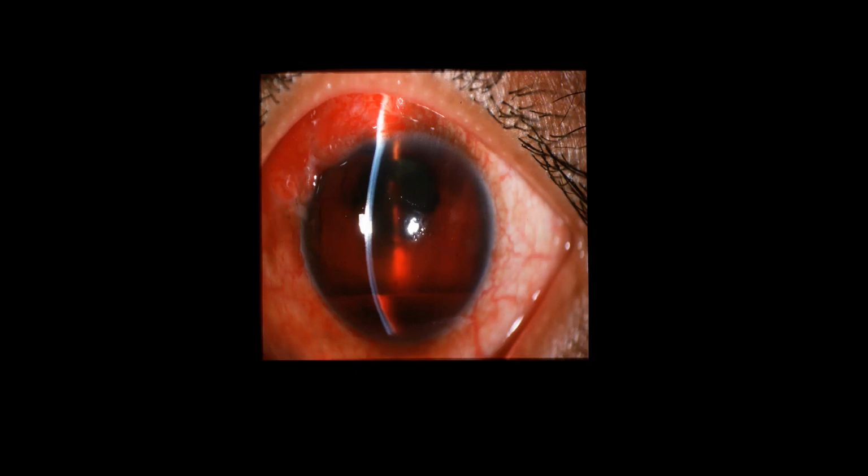What will you do? Okay, so I'll start by taking the history of the patient, then the IOP. So pressure is 20. Okay. What will you do for him now? On exam, I can see the anterior slit lamp photo. Okay, so that's a subconjunctival hemorrhage superiorly coming at the bleb area, right? And you can see that there is hyphema and blood clot in the anterior chamber. Posterior chamber is fine.